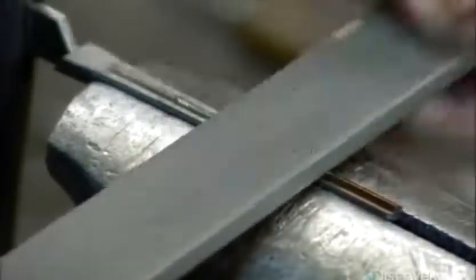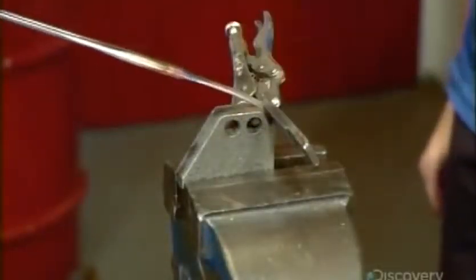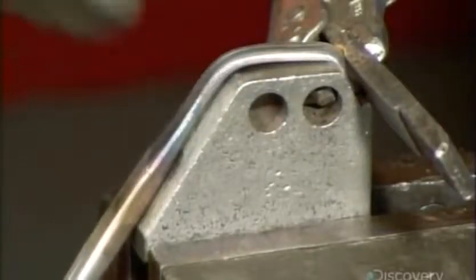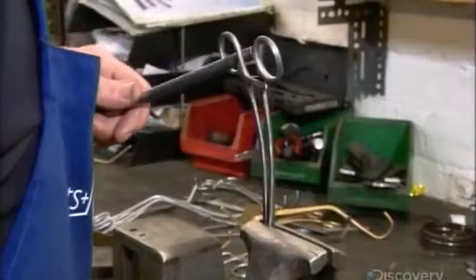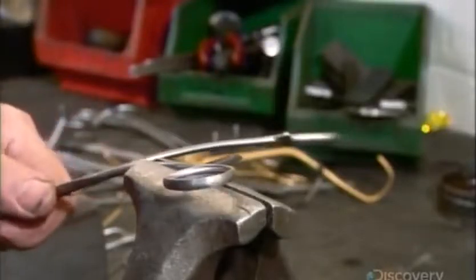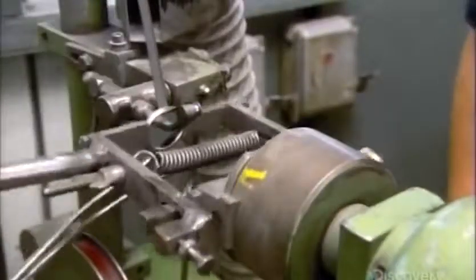He hammers the joint to close the opening, and the two arms of this surgical clamp are now hinged together. Next, he files the teeth of the clamp so they'll interlock when the tool is closed. He bends the two ends around a tool to form the jaws of the clamp. These curved jaws will come in handy when the surgeon needs to reach around organs or bone. Using a variety of tools, he adjusts the shanks and the finger bows to give them a more ergonomic feel — this is called soft setting, because at this point the metal is still soft enough to be manipulated. He tweaks the bend of the jaws until he's satisfied with the curvature.